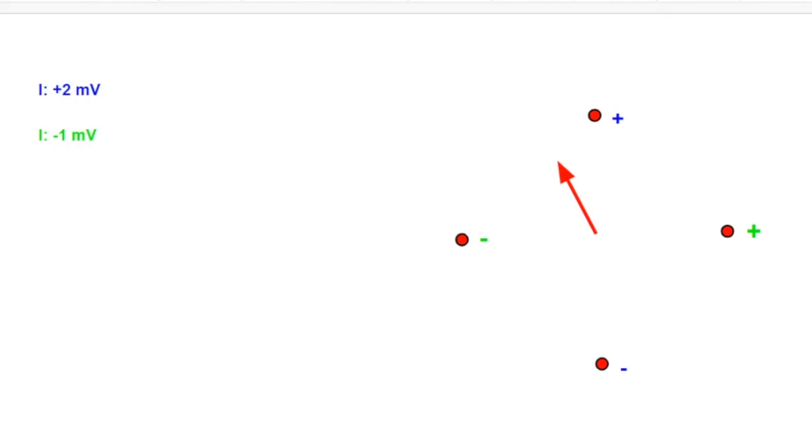Is it really useful to have the third dimension when you're doing stuff in the heart? Maybe. Maybe we don't know. So typically we think of the most common types of heart conduction issues as left versus right side. But I could think of a scenario where you maybe have a re-entrant circuit that's going around the front to back of the heart. And in theory, a vector cardiogram that had the third dimension would show an oscillating vector going back to front, back to front, back to front.